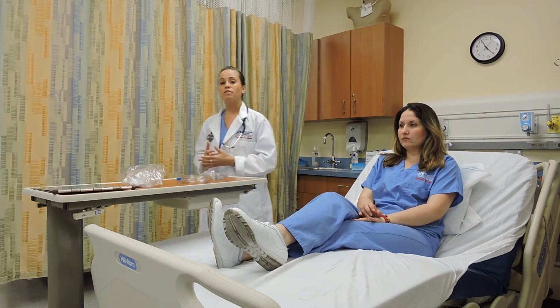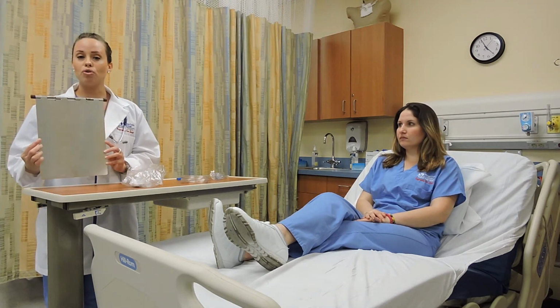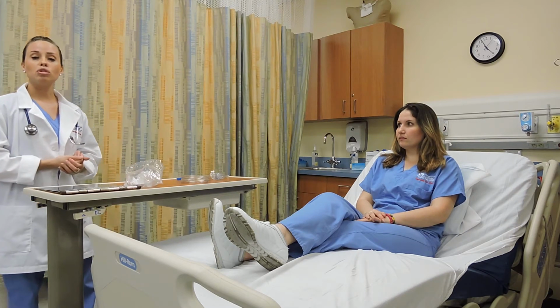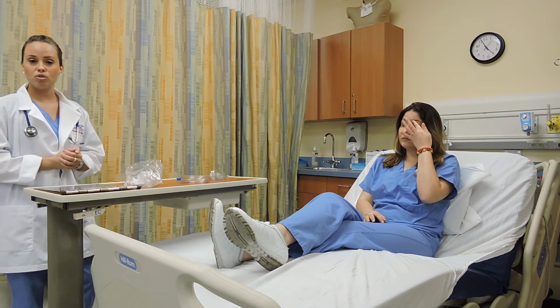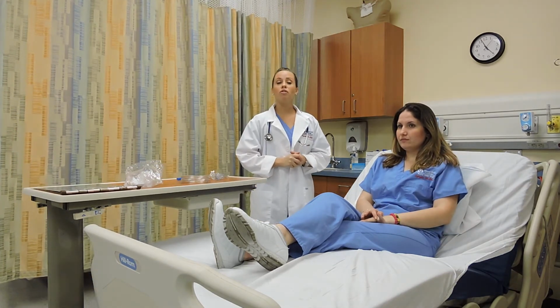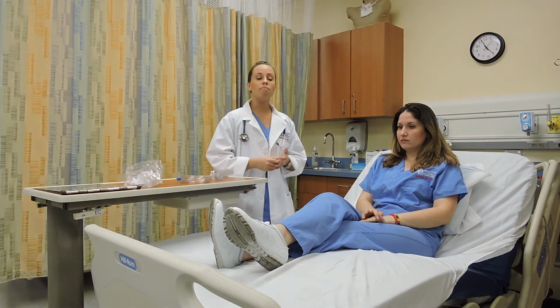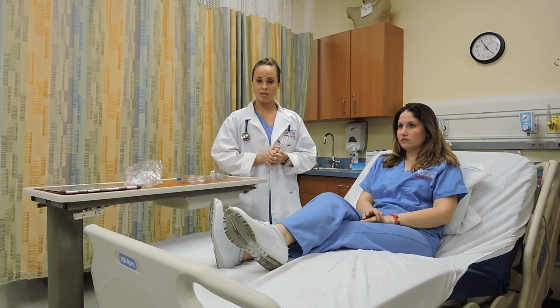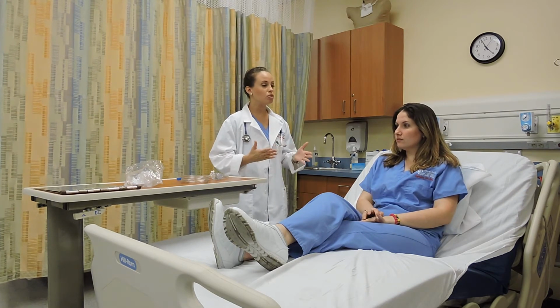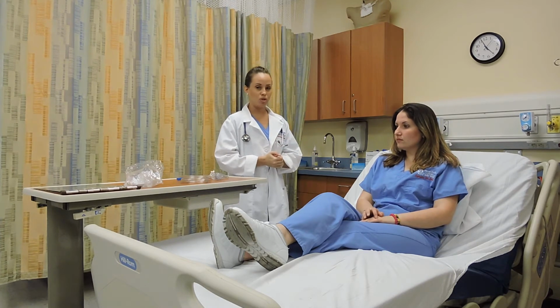All right, first thing to begin my therapy is to verify in my patient's chart the physician's order for EzPap. Before I walk into the room, make sure to knock on the door and wait for authorization to come in. Then I'll introduce myself as a respiratory therapy student, and I'll explain the nature of my visit in terms that my patient or his relative will understand. Hi, Ms. Sanchez. My name is Maria. I'm a respiratory therapy student, and I'm here today because the doctor prescribed EzPap to help you mobilize your secretions.